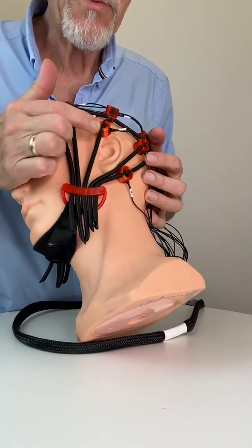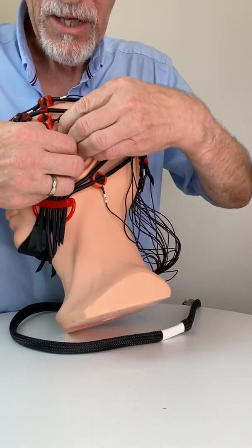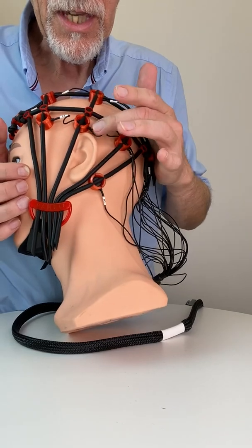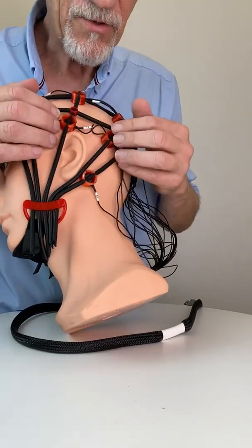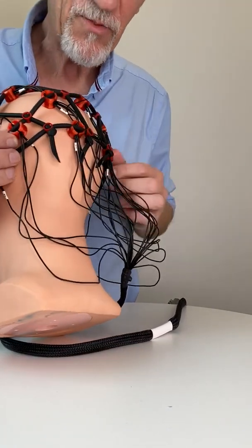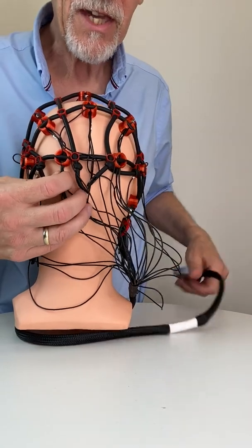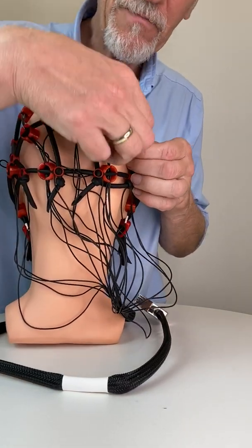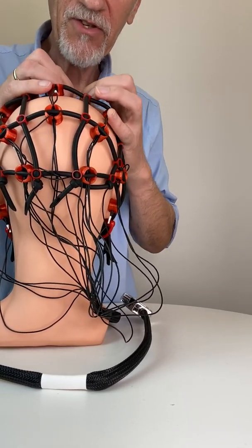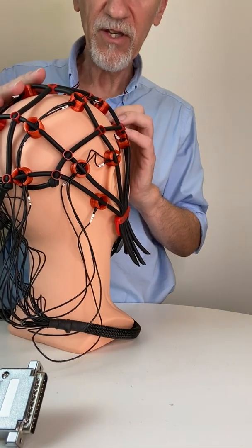This is a very important one — it should stay on T3 or T4, and it almost does already. Here is T3. We already have roughly our positions because the free cap helps you to find the positions. It's not super accurate because you can adjust it individually to the head size and shape of your client's head. There's a lot of freedom in it, but it helps you to find the right positions if you know the 10-20 system.